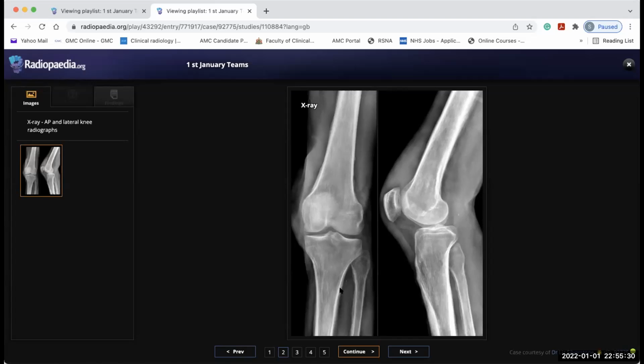And this? Okay, so there is some periosteal reaction around the upper tibia and fibula, as well as here, you can see it here also. Maybe interrupted and not continuous, but we have it here also. Sometimes it is seen in case of venous insufficiency. Great, so this is one of the differentials, correct?